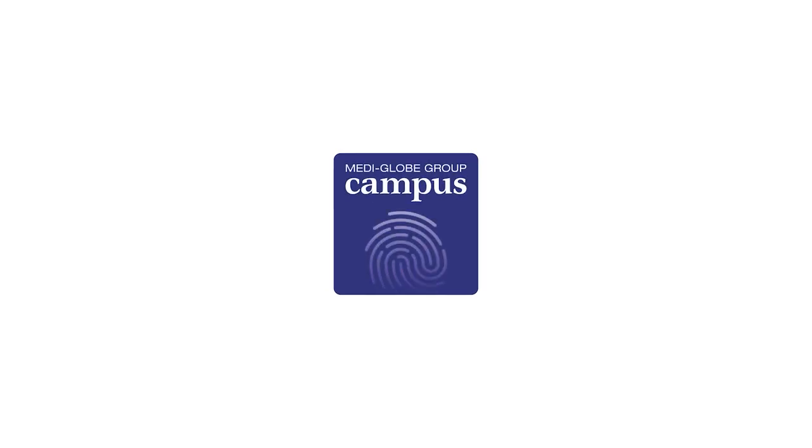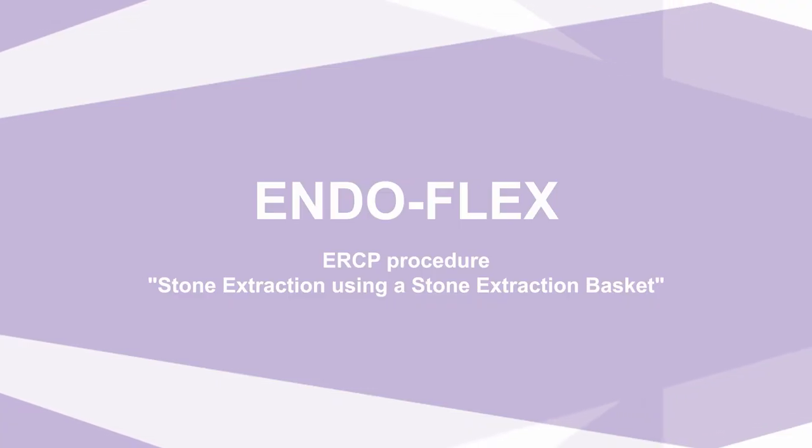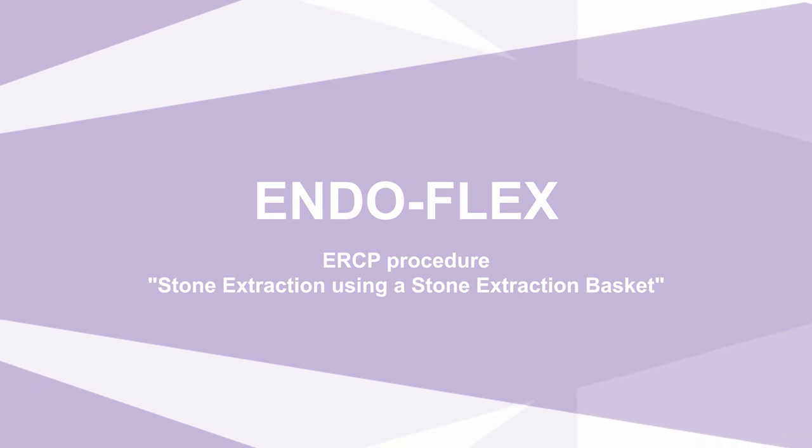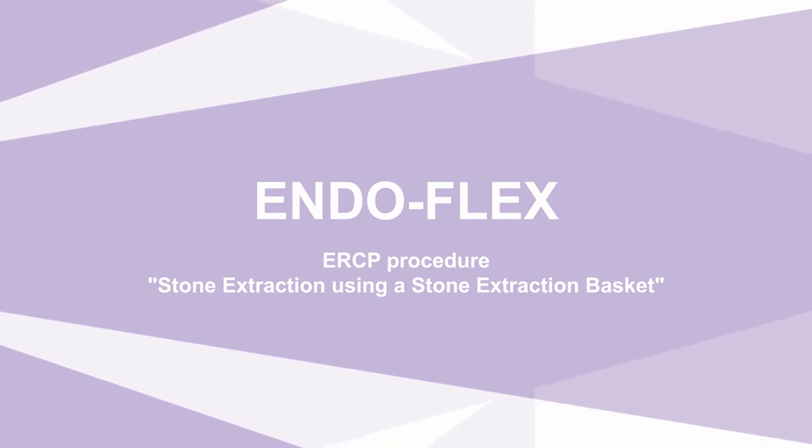MediGlobe Campus — education and training for physicians, assistants, and medical device consultants. Endoscopic retrograde cholangiopancreatography, discipline: stone extraction using a stone extraction basket.